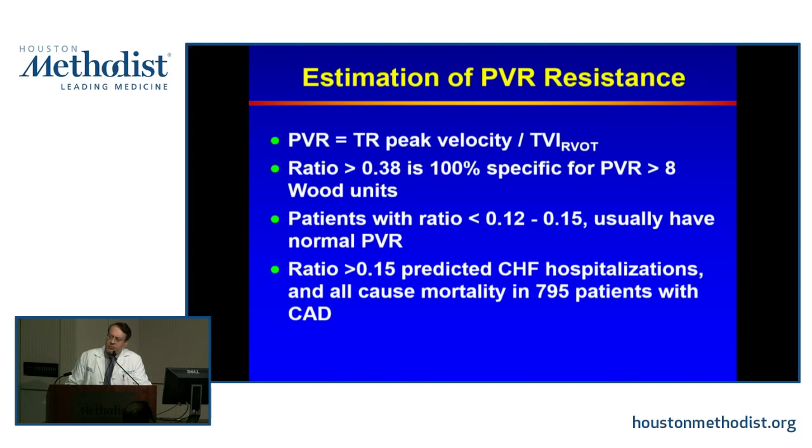Most labs do not use PVR, and the guidelines do not endorse calculating PVR across the board. Where thinking of PVR can be of value would be in athletes, probably with exercise. The PA pressure is dependent on flow and resistance. And so if you have a very large flow into the pulmonary circulation with a PVR that is normal, the PA systolic can rise to even 55 and 60. This is not the same as someone who, say, at a low level of exercise where their cardiac output doesn't increase much, and they end up with that same value of 60 millimeters mercury.